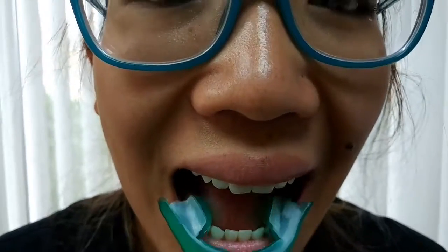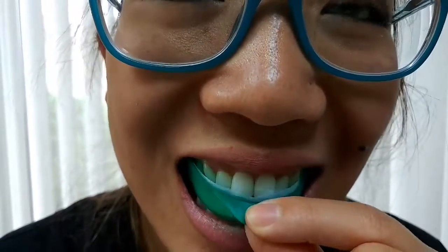To begin the whitening process, position the upper tray on your upper arch and create a seal by gently swallowing and creating a suction.